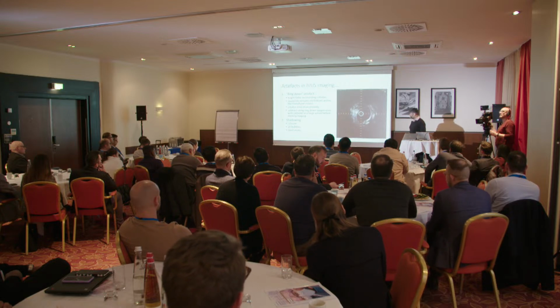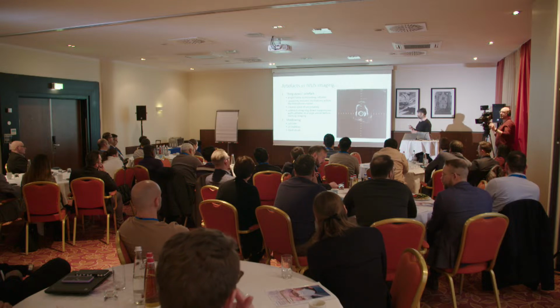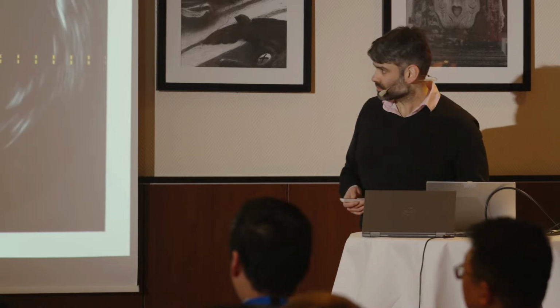Stent struts, again, you can't really do too much about it, but if you can see a stent strut separated from the arterial wall, that gives you a target to treat.